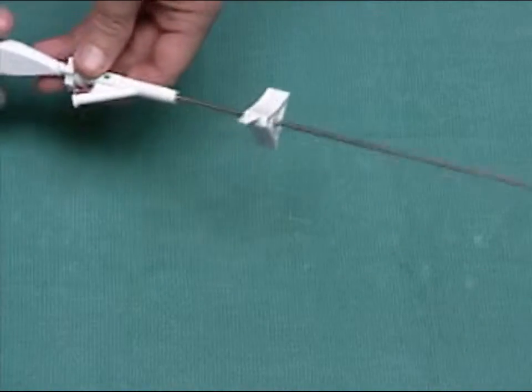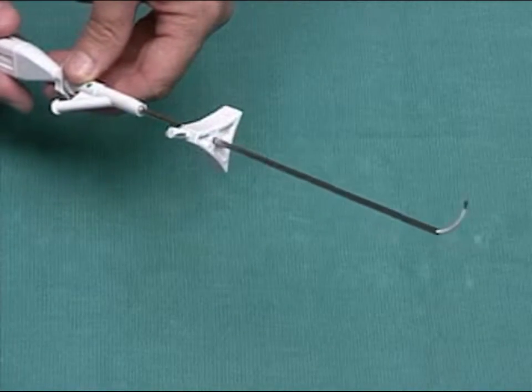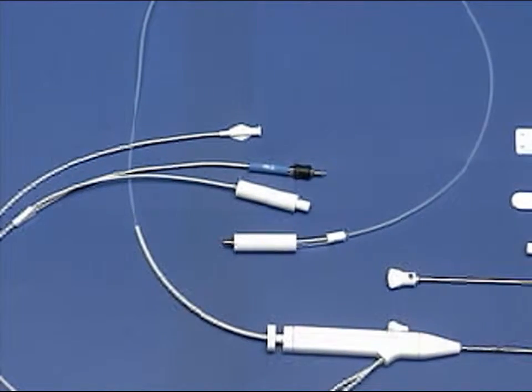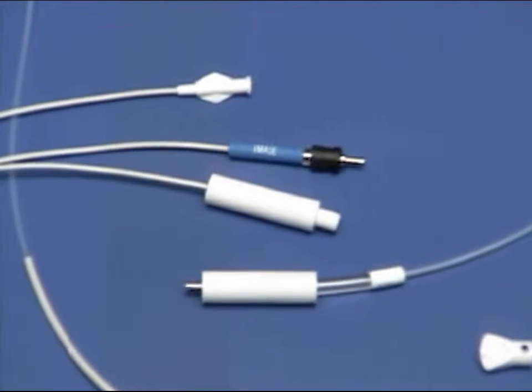This is the LASE endoscope. The LASE endoscope is actively deflectable and contains a built-in laser fiber. It has four connections: image, illumination, irrigation, and laser.